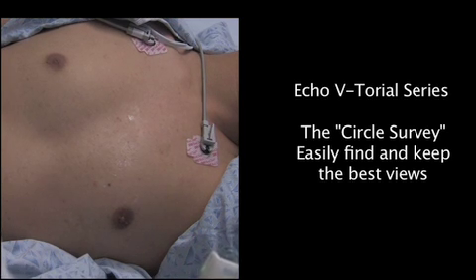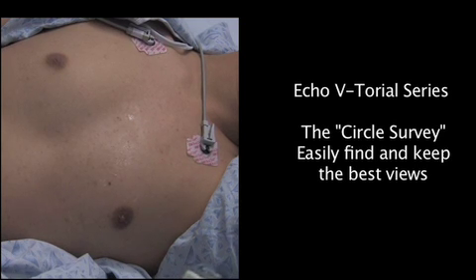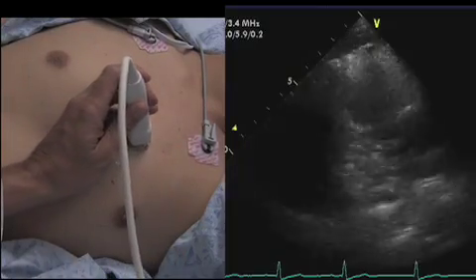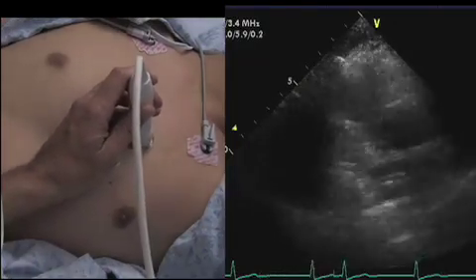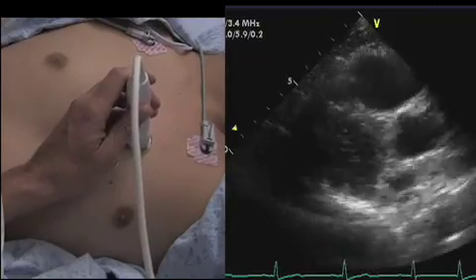We're going to review some of the methods for beginning sonographers to really help master the basics of echocardiography. The first place I like to start is what I call a circle survey, and what some people call window shopping. We're basically looking to find the window.